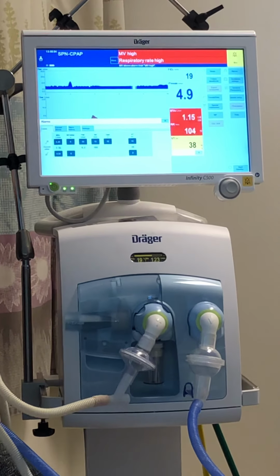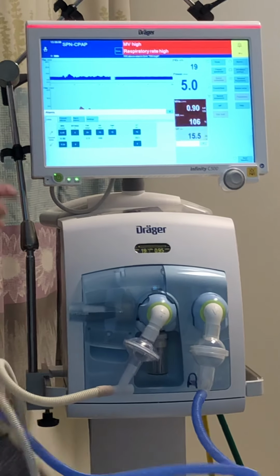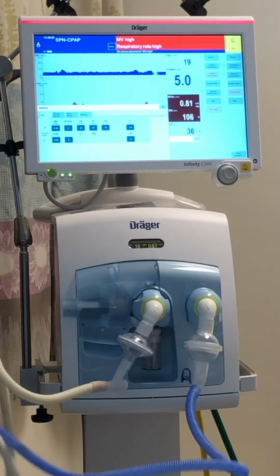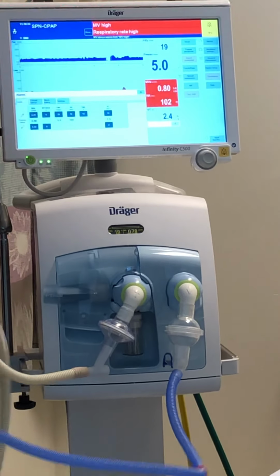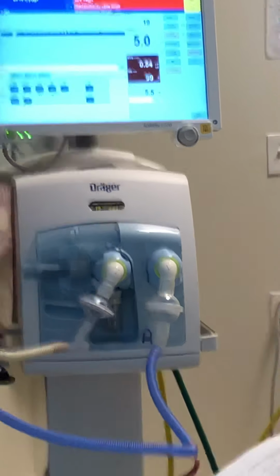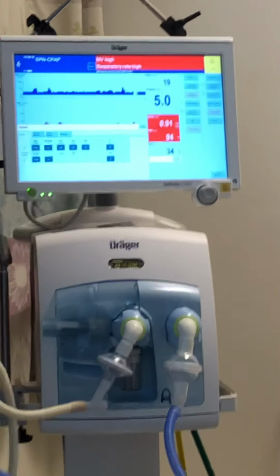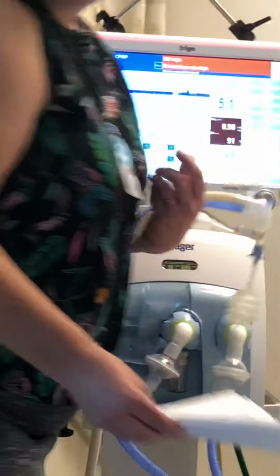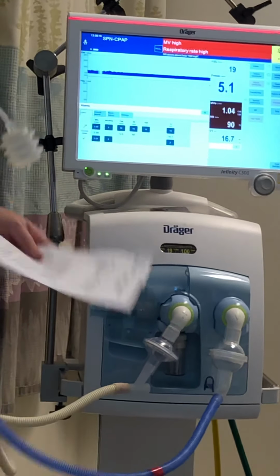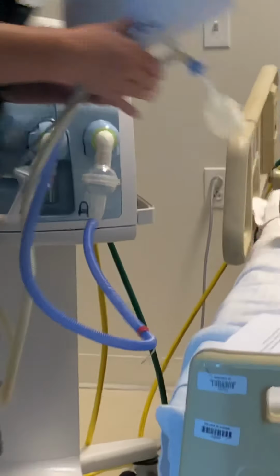For our class, I will tell you what alarms I want you to set. I just want you to be mindful: you have to tell me, I'm gonna set these alarms. And I'll tell you, okay, go ahead and set the apnea alarm, go ahead and set the pressure alarm. Does that make sense? Yes. Okay. Other questions on the nasal CPAP setup? What part was it that you wanted us to take apart and put back together to practice? The prongs, the actual prongs.